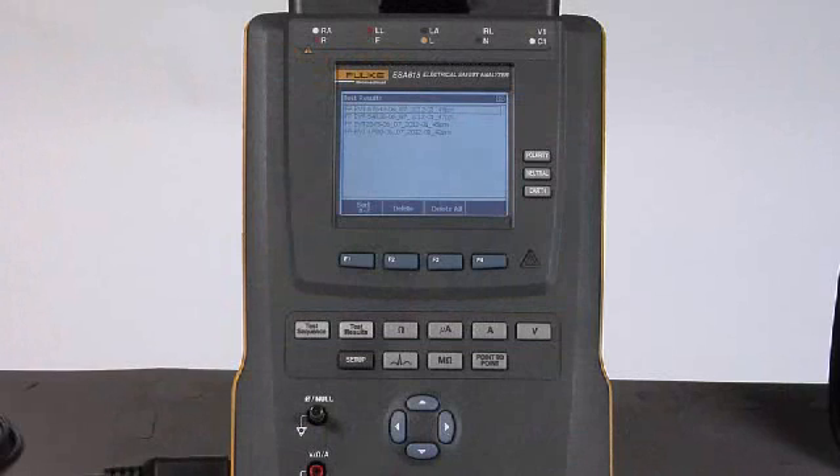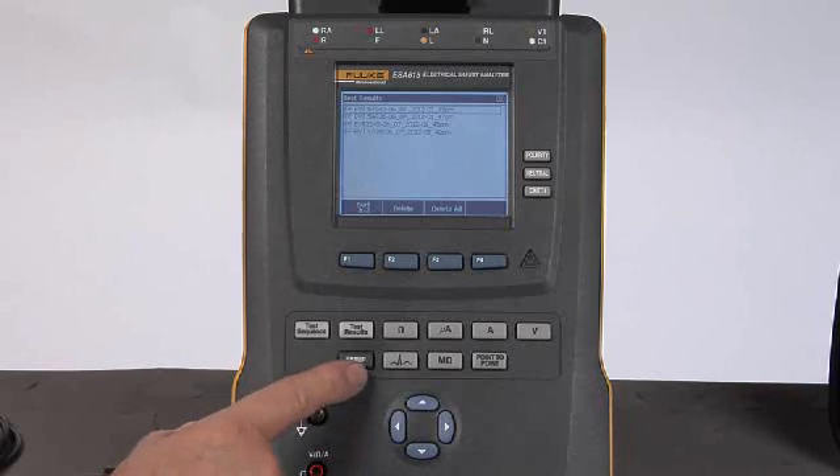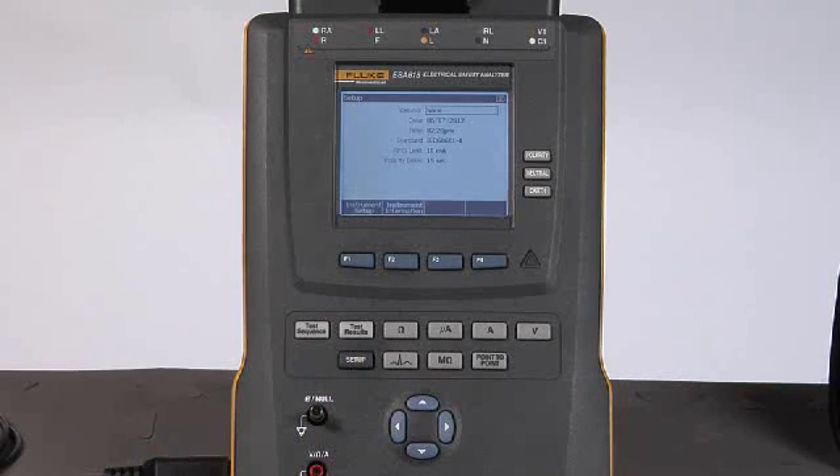The ESA615 can also be operated manually. When doing so, it's important to ensure a couple of settings are properly made. Press the setup button to select the operator — you can select yourself or any others in the list, with as many people as needed. The other important setting is the standard: arrow down to the standard and press enter to select from a list of US and international standards that will form the foundation of your tests. The rest of the controls on the ESA615 should look very familiar, as they are the same as those found on the ESA612 and ESA620.